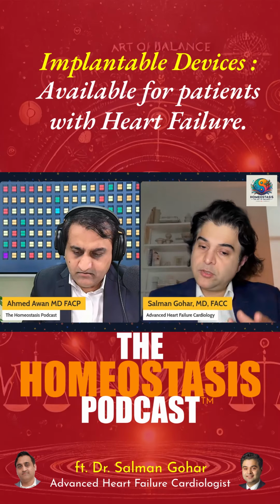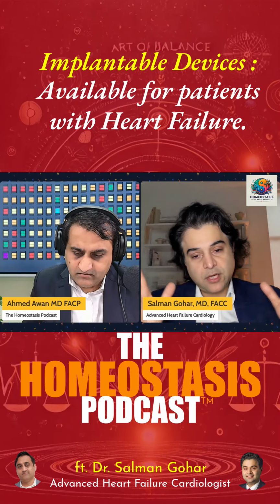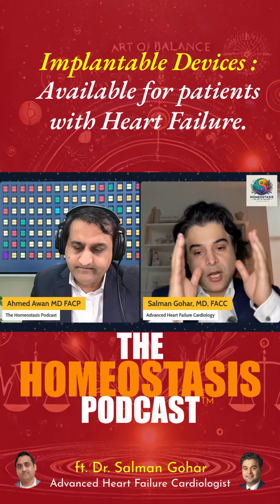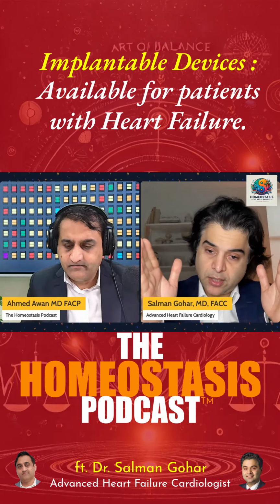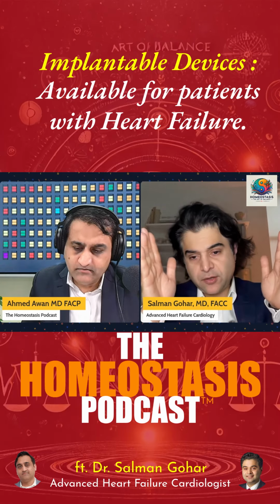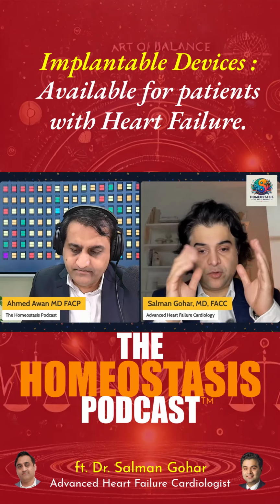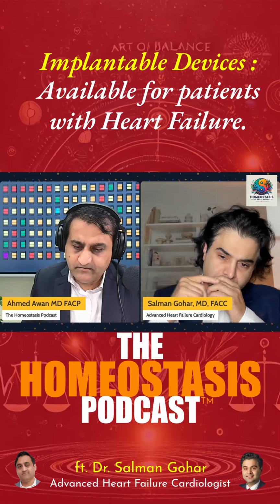So when that left bundle gets affected, instead of the left side doing this, it now starts doing this. So now it's dyssynchronous. And the wider the left bundle or the QRS complex, which really should be a spike on the left on the 12 lead EKG, the more that correlates with the left ventricle being dyssynchronous. And I give the example for a lot of my patients of an engine, right?